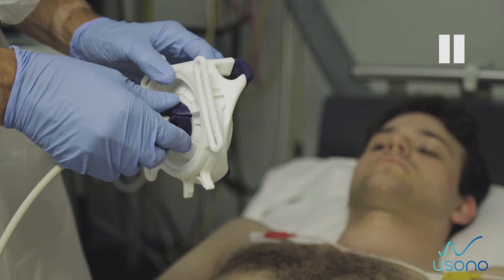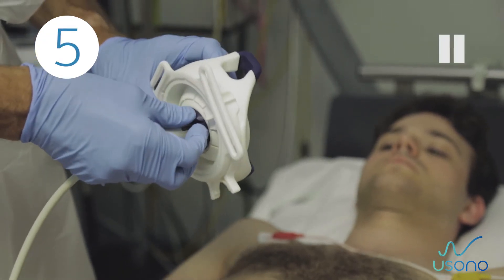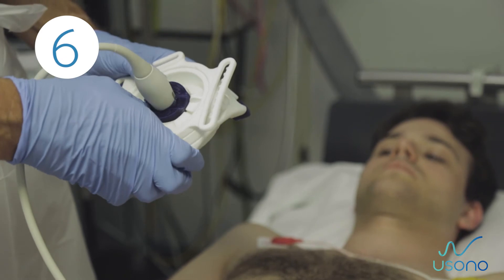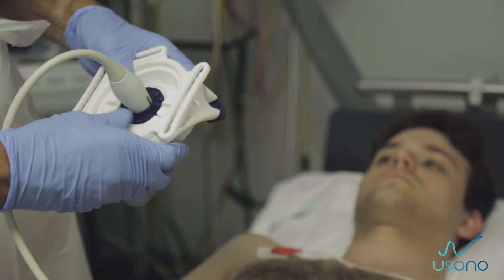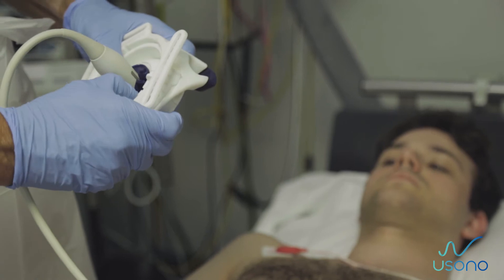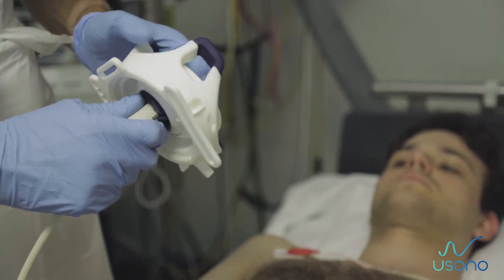Step 5: Push on the probe and the silicon ring insert until the insert is completely inside the probe fix. Step 6: Using both thumbs, apply pressure in the area around the insert to adjust it and ensure that it is fixed and completely inserted into the probe fix.